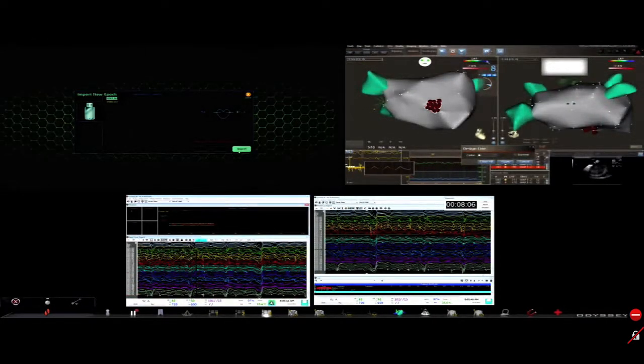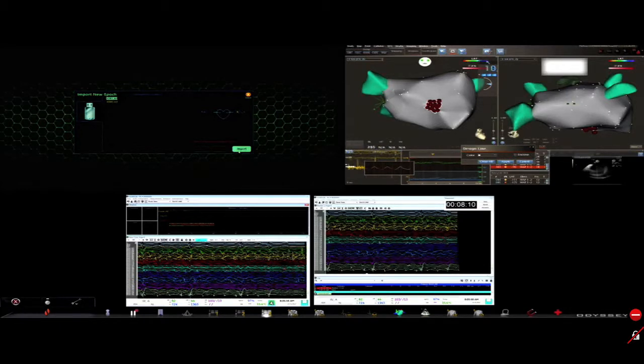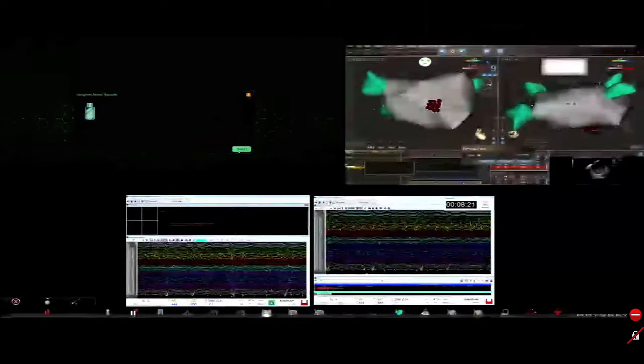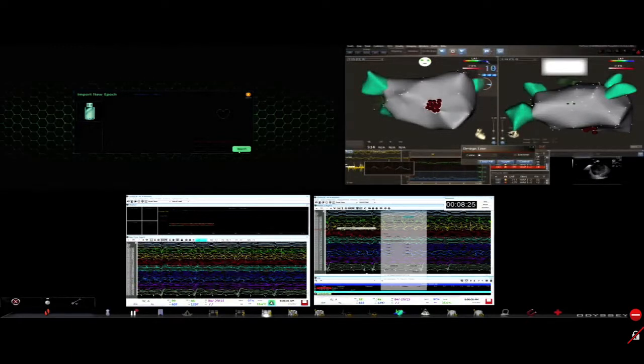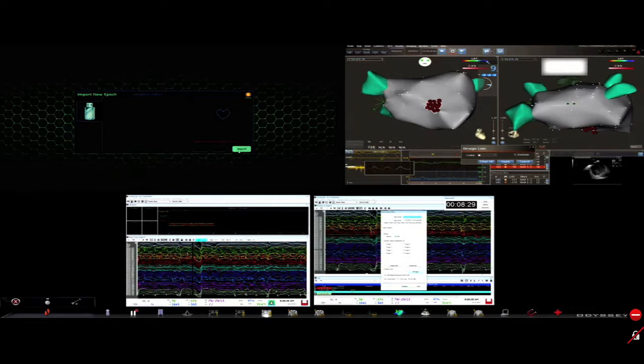Sometimes this is actually determined by a number of recording points, about 64 electrodes, in a confined atrial size. So the typical area is somewhere between 2 to 4 centimeters squared, at around 3. So that's the average size overall. Brian, if you want, we can quickly measure the area for you.